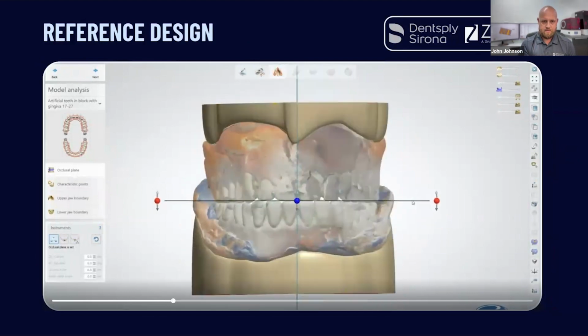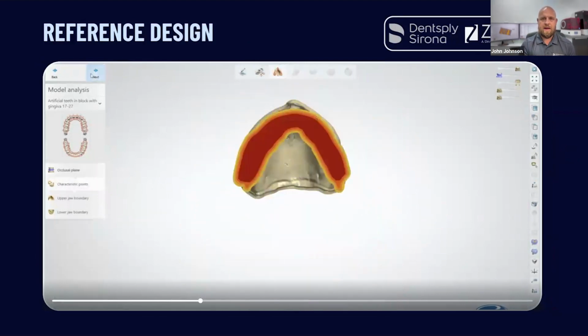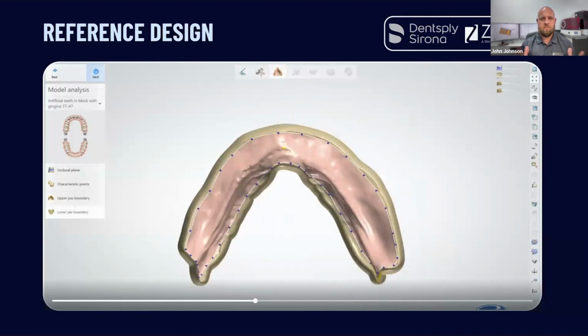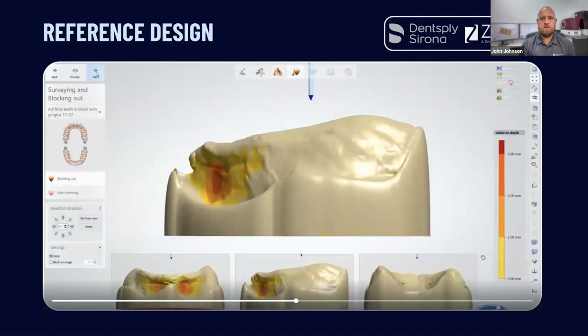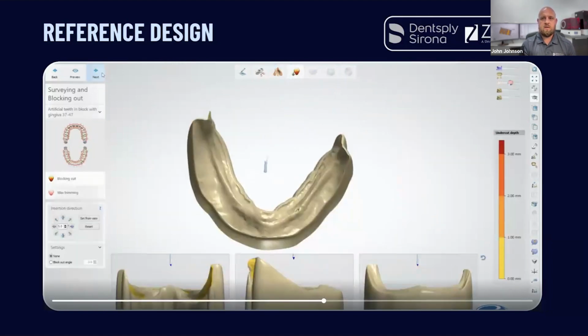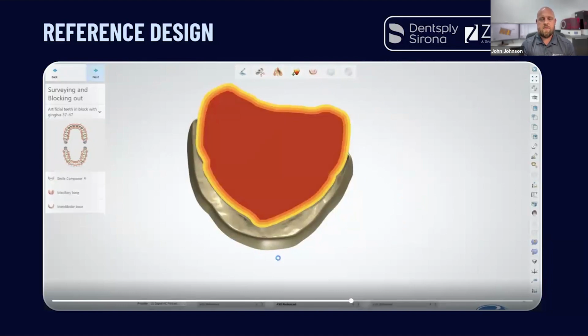I'm able to bring back in those other images of her denture and do the same alignment, bring them back together. And now I'm into creating her new dentures based off of the wash impression, which is going to improve the fit of those existing dentures. It's going to be an incredibly accurate impression. And then we're going to play with her tooth arrangement. Like I said, we're trying to correct that reverse smile, which kind of took her plane of occlusion down just slightly. And then there's a couple little nuances that we followed.